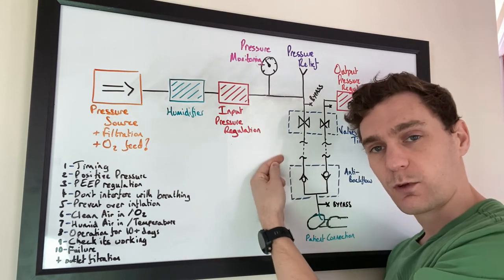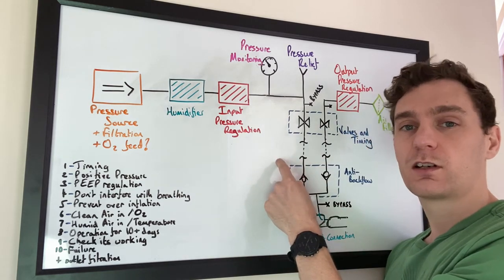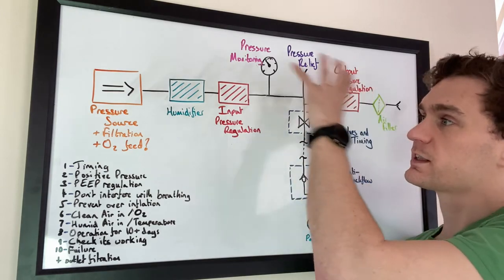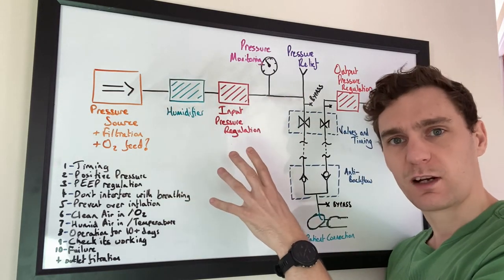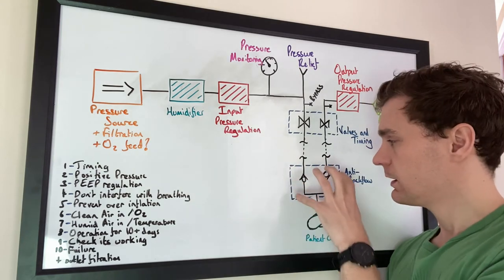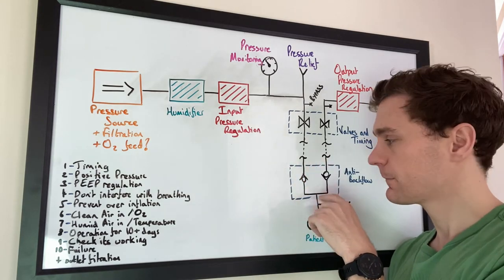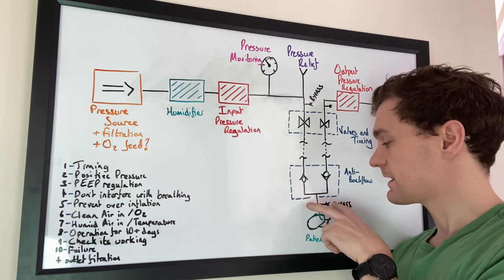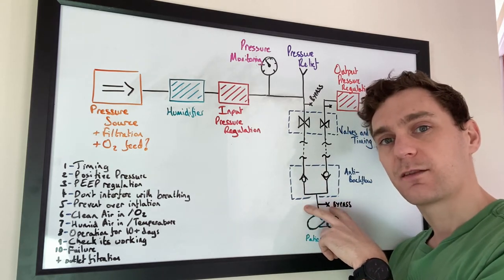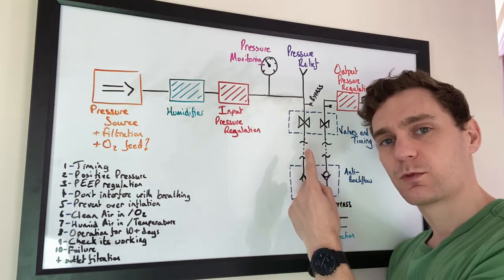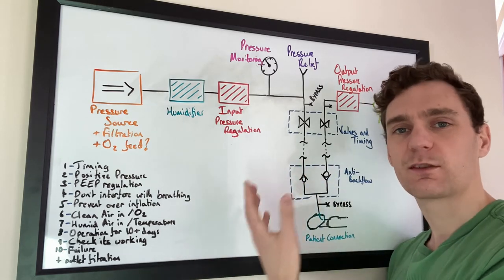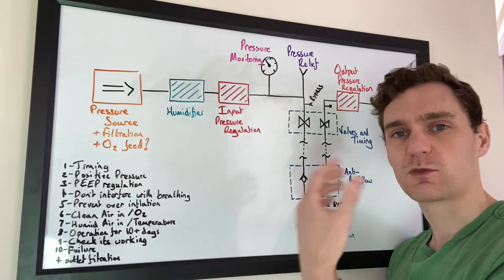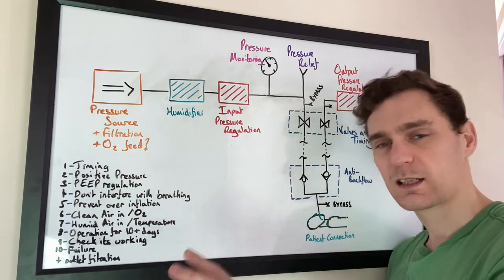Here we have this extended tubing run. This tubing run allows us to have all of this equipment a long way from the patient, relatively long way from the patient, perhaps a few feet, and only this section close to their face. The anti-backflow section prevents air from flowing back up those tubes and just cycling air in and out of the tubes rather than providing fresh air to the lungs so that the patient can absorb that oxygen and expel the CO2.